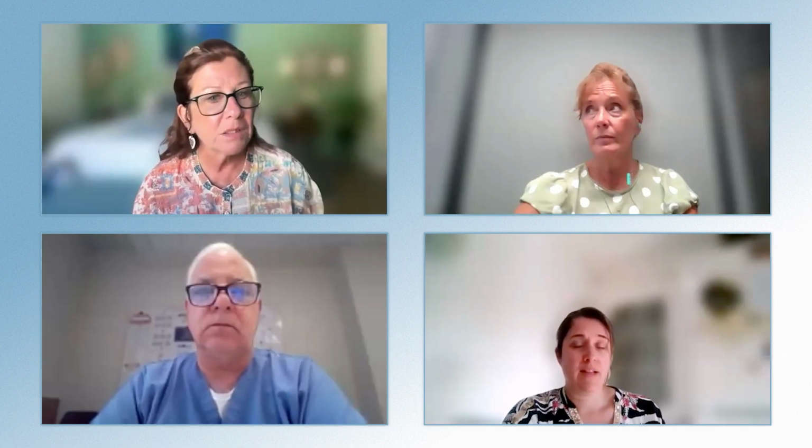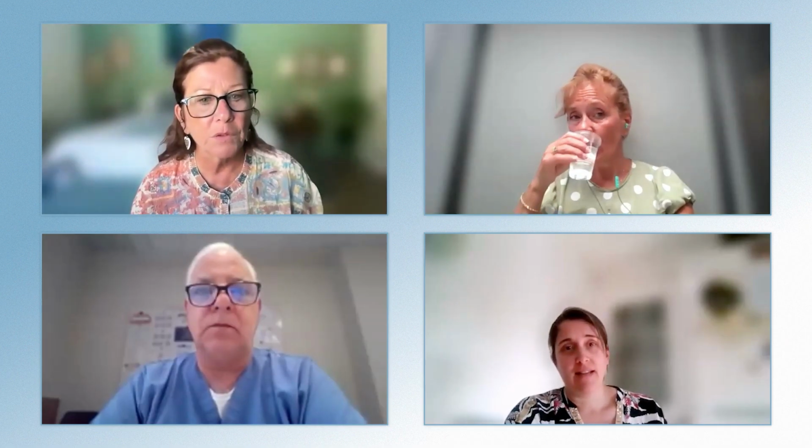Thank you. Christina, is this something that you've seen in your institutions? I agree with her. These devices are used in cath labs when patients come with an STEMI or in A&E. And again, our patients don't have prolonged CPR. They should be reopened. So it kind of contradicts the whole concept of CALS, because by the time that you put this device on, which doesn't look simple to me, I haven't put any, but I've seen it a few times, you're ready to reopen.